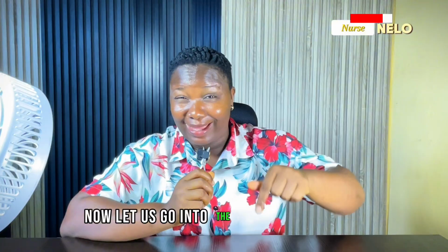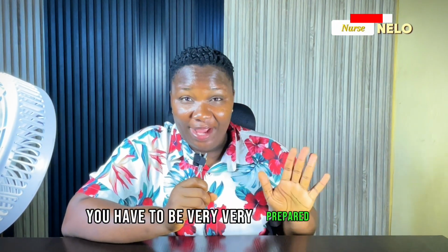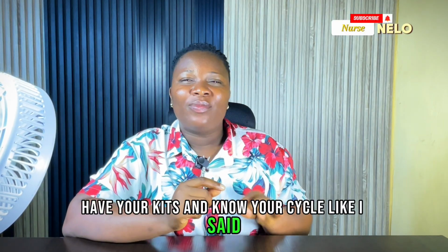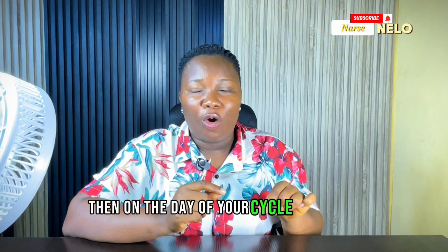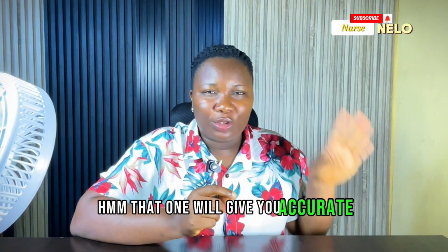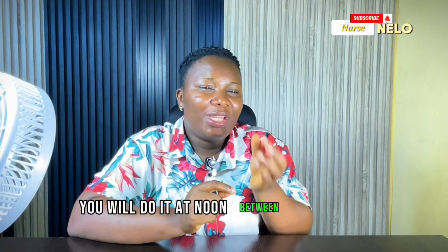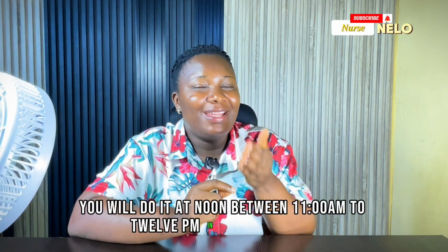Now let us go into the tracking properly. When you want to start tracking, you have to be very, very prepared, ready, have your kit and know your cycle, like I've said. Then on the day of the tracking, you will test by noon. Some people make the mistake of testing early morning, just like pregnancy. No, in pregnancy tests, you will do early morning urine. That one will give you an accurate result. While in ovulation testing, you will do it at noon, between 11 a.m. to 12 p.m. in the afternoon.